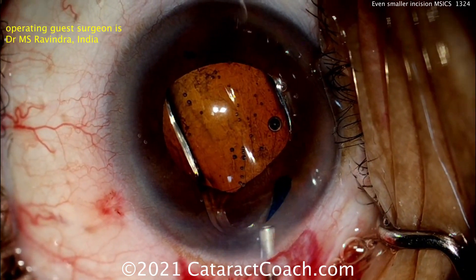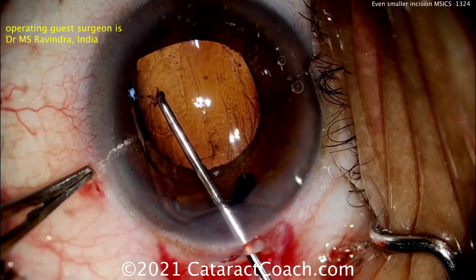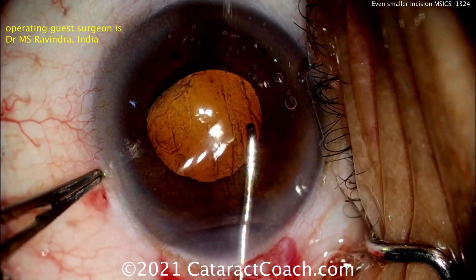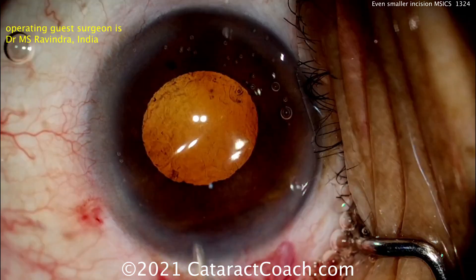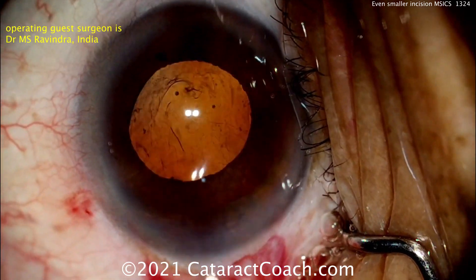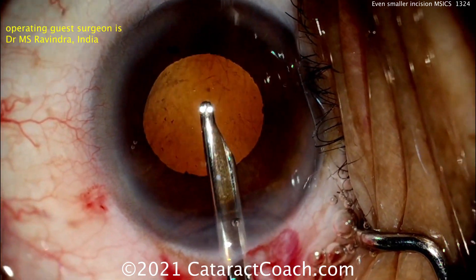So neat technique — you can learn this as well. I learn a lot more by doing CataractCoach than I ever learned in my life. This is a very helpful thing for me; I learn by making videos. I learned in this case the technique of using chopsticks — the chopstick technique of holding that nucleus and bringing it up out of the bag. I like that very much.